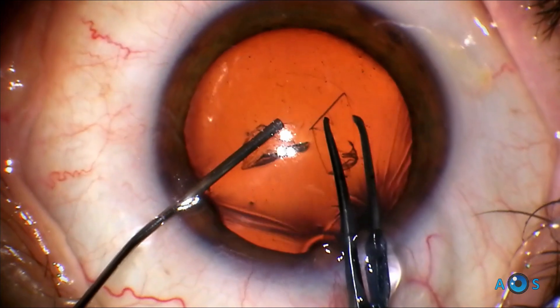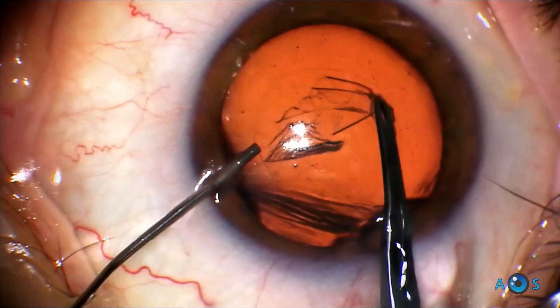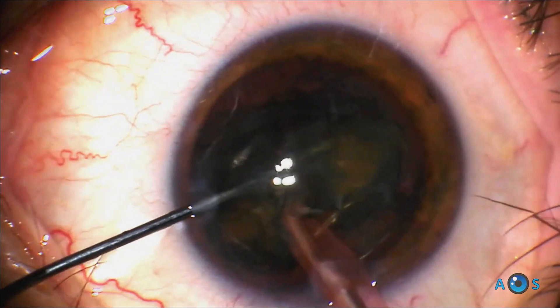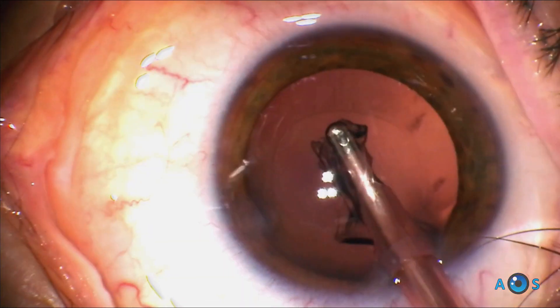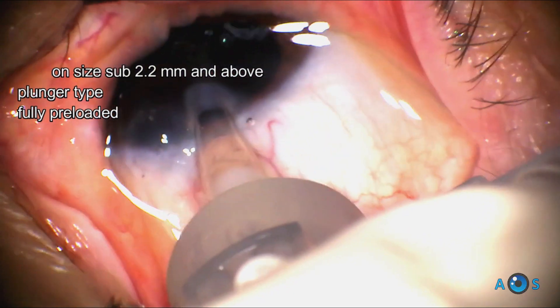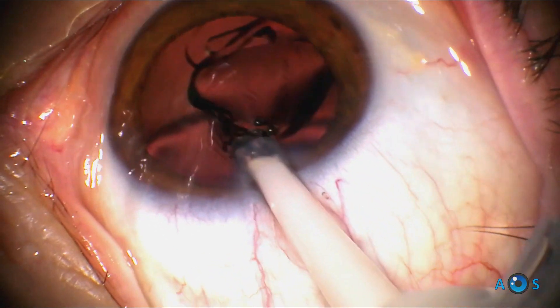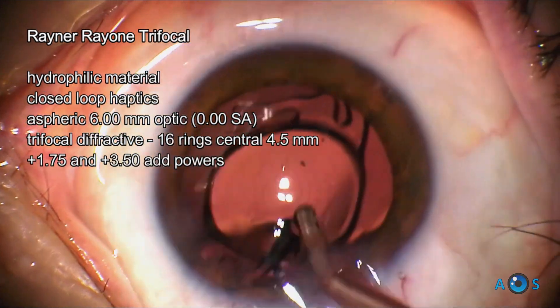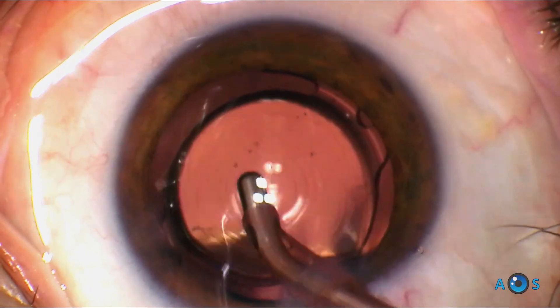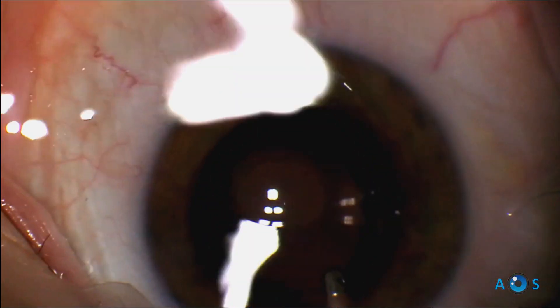Moving on to the next lens, the Rayner RayOne trifocal is one of the most recent multifocal IOLs, claiming to allow about 89% of light transmission to the retina, which theoretically would diminish the occurrence of dysphotopsia. Phaco proceeds using chopping maneuvers and then cortical aspiration. A strong point of the RayOne family of lenses is that they come preloaded in a very simple and elegant injector, suitable for implant through 2.2 mm or even smaller corneal incisions. The lens is made of hydrophilic acrylic material and as the plunger is depressed the lens quickly unfolds in the capsular bag. One thing that is apparent with this lens is the stability afforded by the closed-loop haptics; the optic remains very well centered despite the aspiration maneuvers.